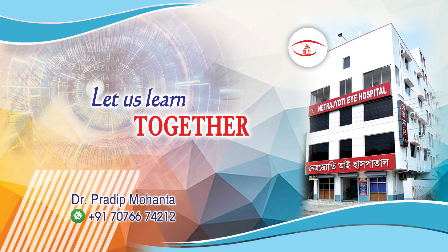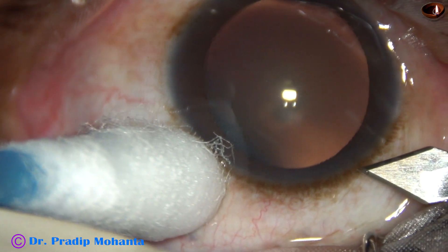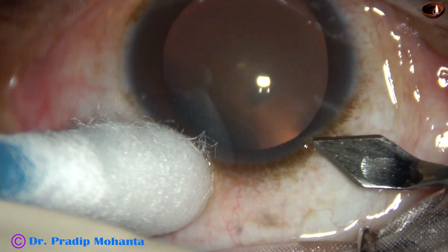Friends, welcome to my workplace at Ranaghat, West Bengal, India. This is a posterior subcapsular cataract. Let us observe this surgery.